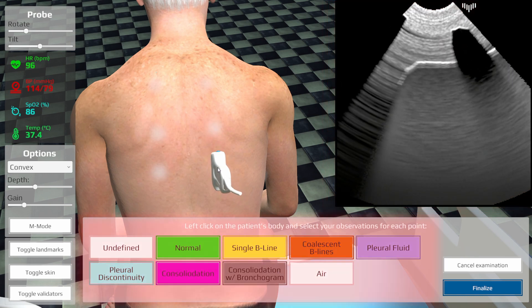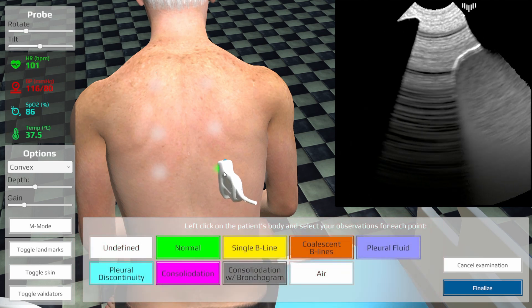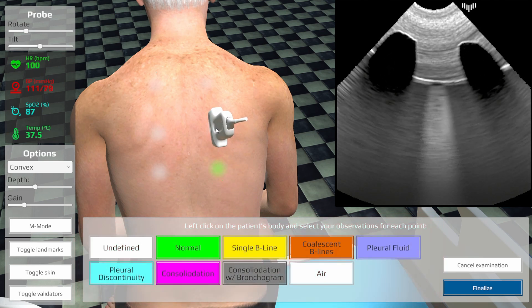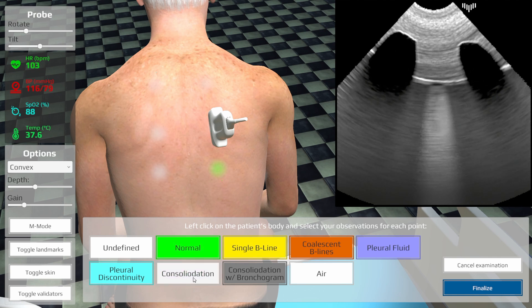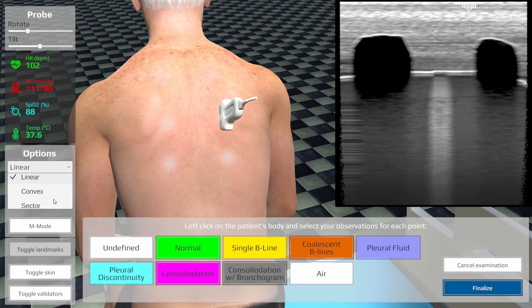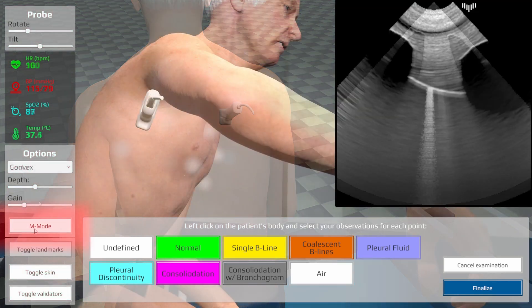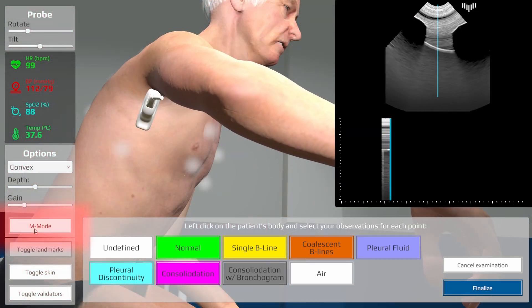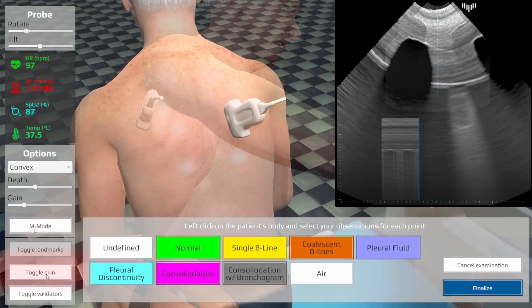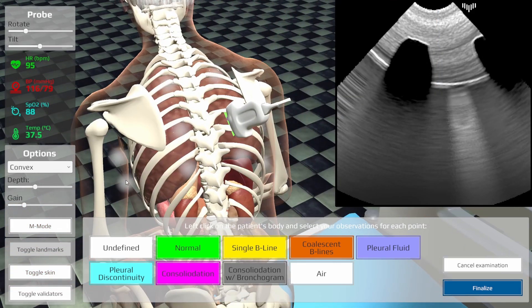You can now select one of the findings in each landmark, which will then glow in the selected colour. You can rotate, tilt, or select different probes using the left panel. M mode is also available, and you can hide the landmarks or show the anatomy below the skin.